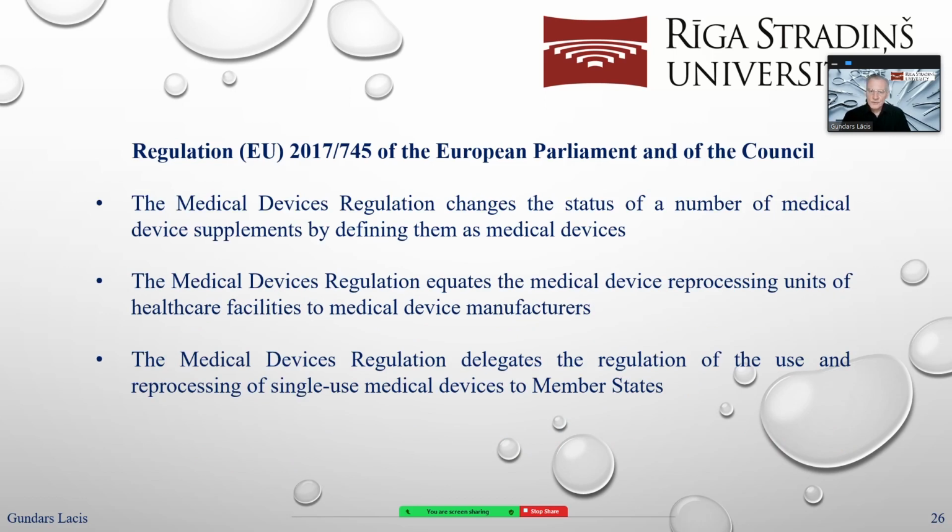And what also is really tricky, the medical device regulation changes the status of a number of medical device supplements by defining them as medical devices. As I said, sterilizers, washer disinfectors, sealers, and so on. They were supplements, but now they are medical devices.